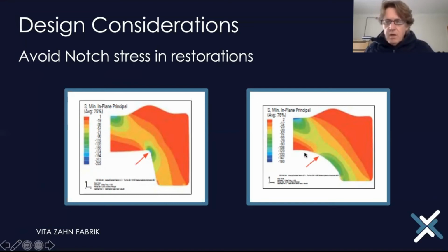On this picture here, you can see that they've indicated that you make a long, soft transition. And that soft transition spreads the bite force and all the other forces that are involved, bonding, the shrinkage, all those things when you do polymerization. And it settles down the stress within the material, which is going to be your restorative material.